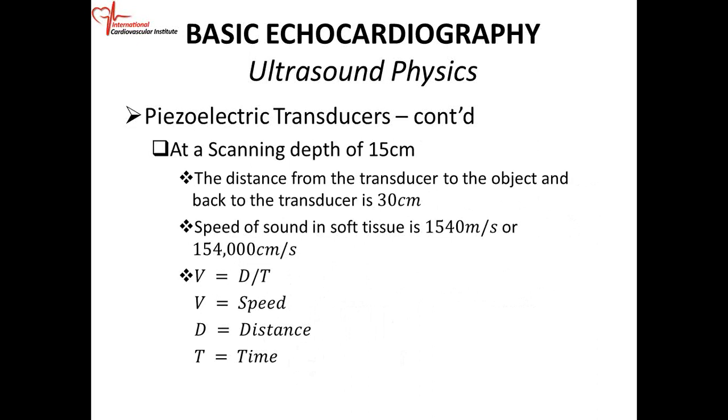All right. So let's look at it in mathematical terms. If we're scanning at a depth of 15 centimeters, the structure is 15 centimeters in depth.